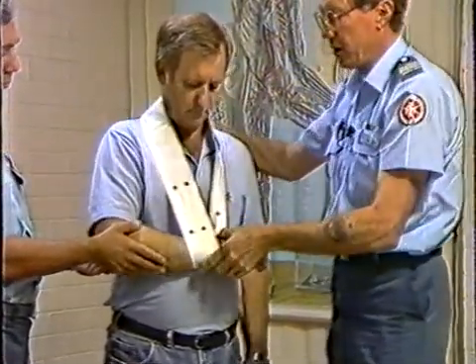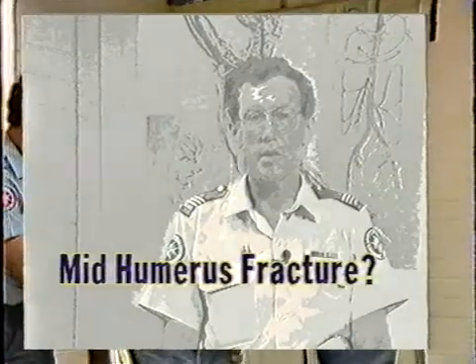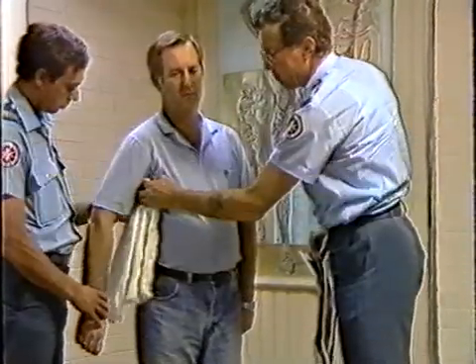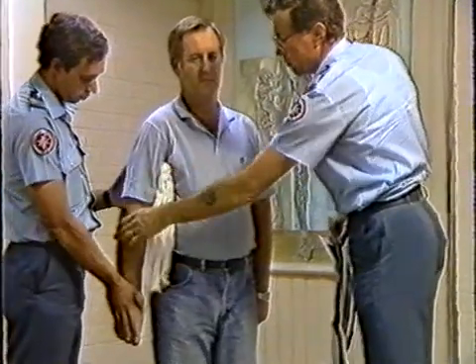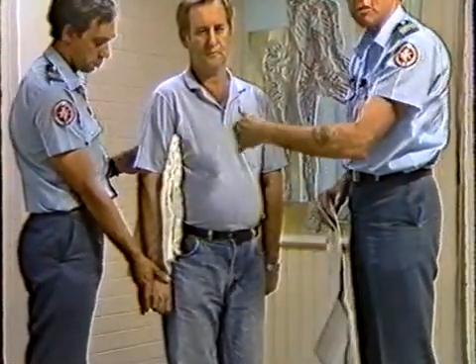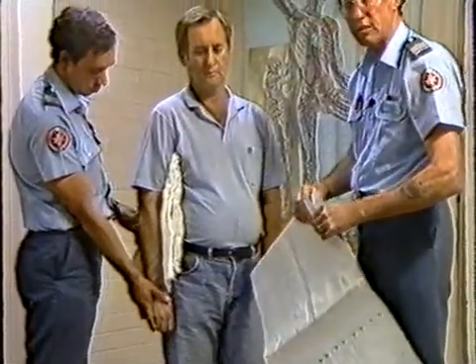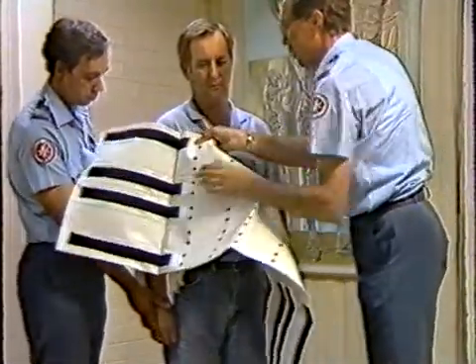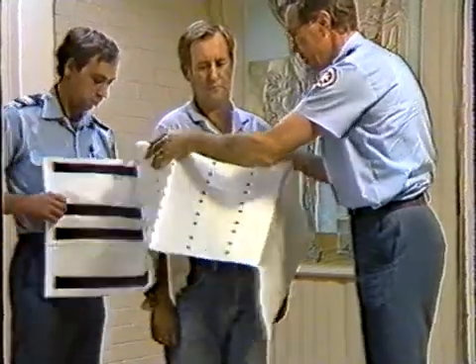In this aspect there, hanging down. So we still have to know that this arm here has a mid-humerus fracture. Just gently lift it out, put the padding up, put the arm back against the body, keeping in mind that now we've got gravity holding the arm down, so we've sort of got a self-traction process going on here, so there's no crepitus. We then feed the large Easton bandage around.